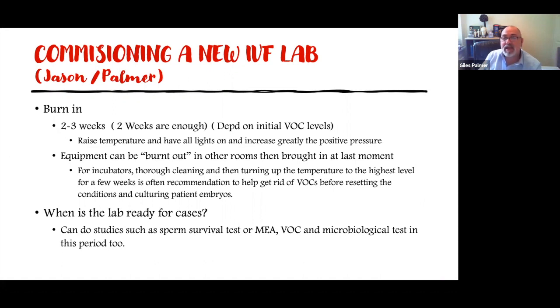New equipment is then burnt off in another area, because you don't want VOCs to be brought into the lab, and then you enter through this false wall and seal that up. But it does take about 2 or 3 weeks to clear, and we can see that with the toxins in the air. And then, of course, you do all your bioassays to make sure, which Jason has mentioned as well.